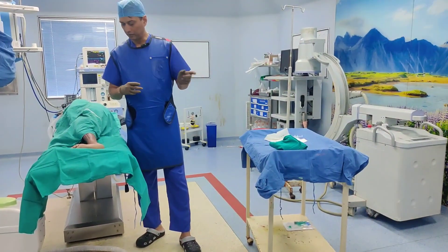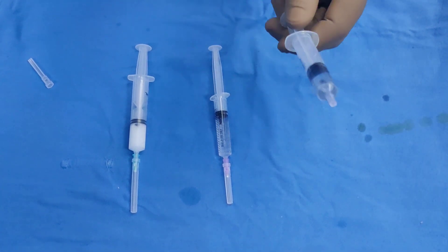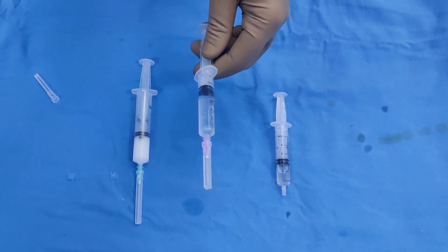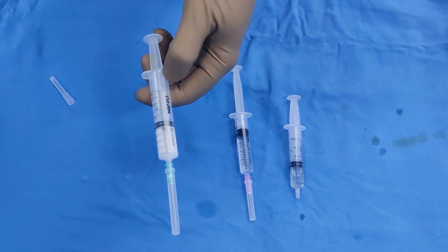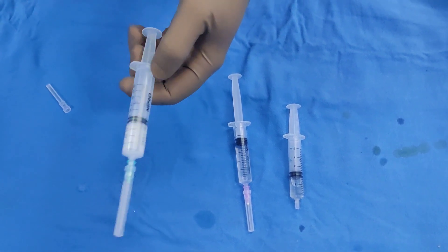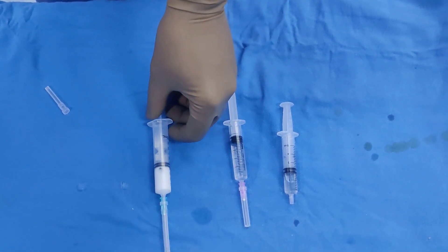I am going to show you what you need on your trolley when injecting a subtalar joint. You need Omnipaque to confirm the position of your needle within the joint, and some local anesthetic applied to the skin so the procedure is not too painful for the patient. The injection mixture is around 4ml — subtalar joint is usually tight and doesn't take more than 3 to 4ml. It is a combination of 80 milligrams of Depomedrone, which is 2ml, and 2ml of plain lignocaine at two percent.